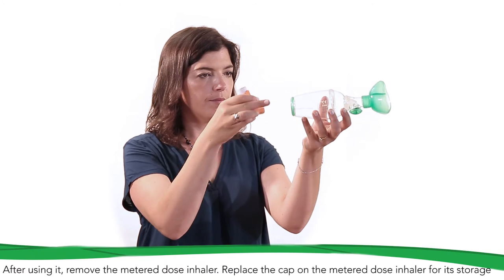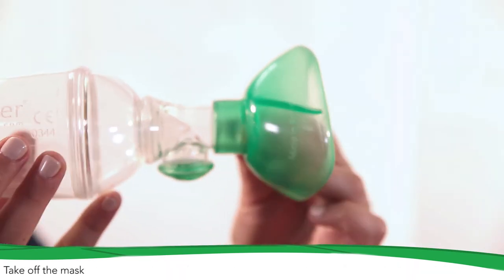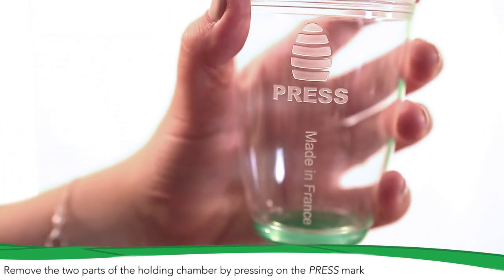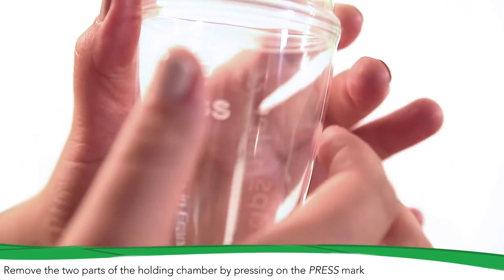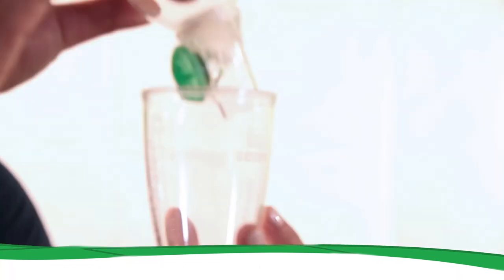After using it, remove the metered dose inhaler and replace the cap. You can store TIPS-HALER in its box after removing the mask from the valved holding chamber. TIPS-HALER must be washed once a week according to the instructions of use.